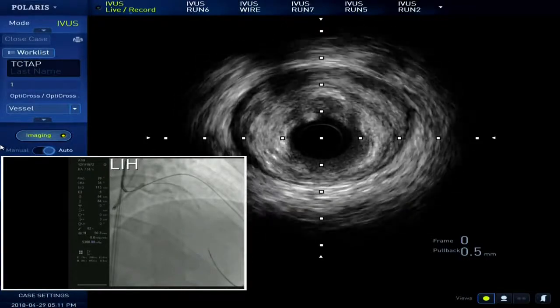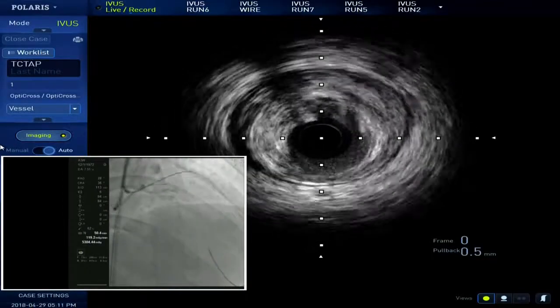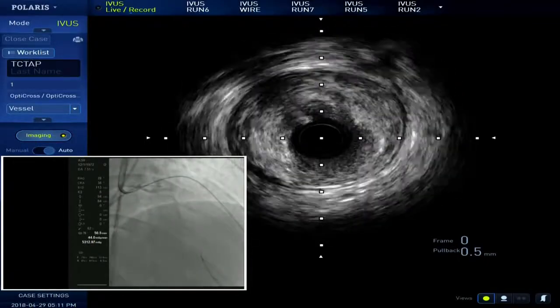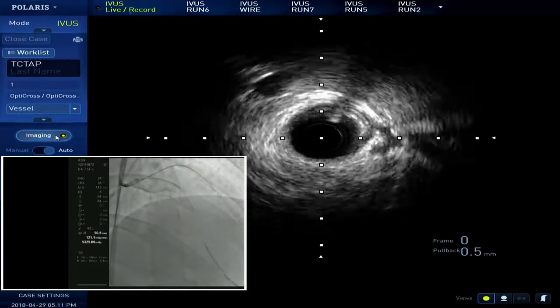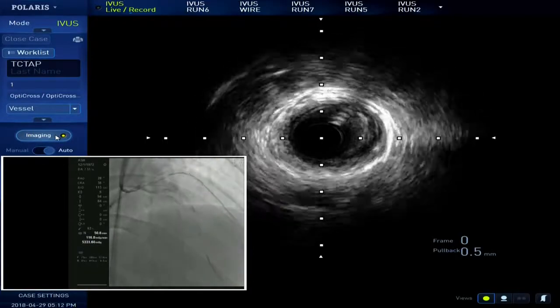This is that one, the antegrade. Yeah, no problem. No hematoma. So I need flushing one more time. Position is changed. Around here. Okay, distal, take a picture.